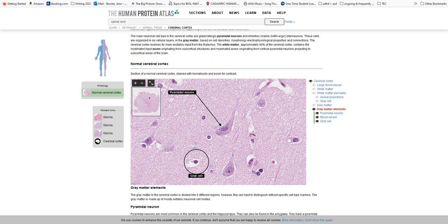Okay, these two that we talked about, Purkinje and pyramidal, are good PowerPoint questions for the lab exam. So make a note of that. These might show up, or the images from our modules might show up on a PowerPoint slide.